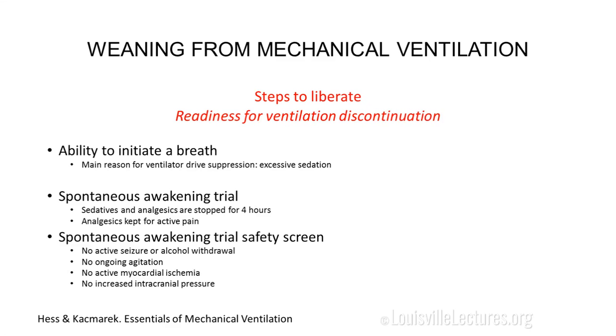Finally, you want to make sure the patient can initiate a breath. And I can tell you that the main reason why patients do not initiate a breath is that they are being sedated. So you want to do what we call a spontaneous awakening trial, okay? So that means you're going to stop sedatives and analgesics to the extent that is possible.